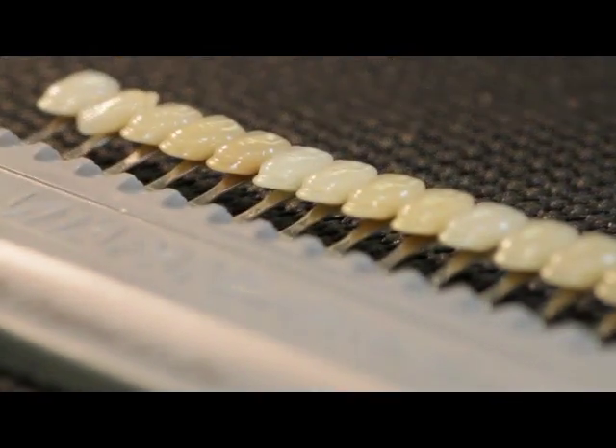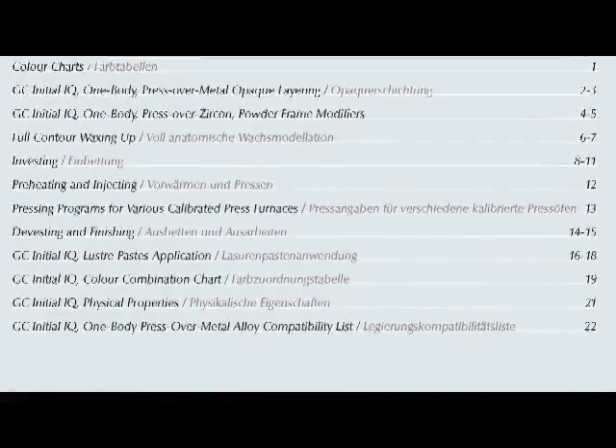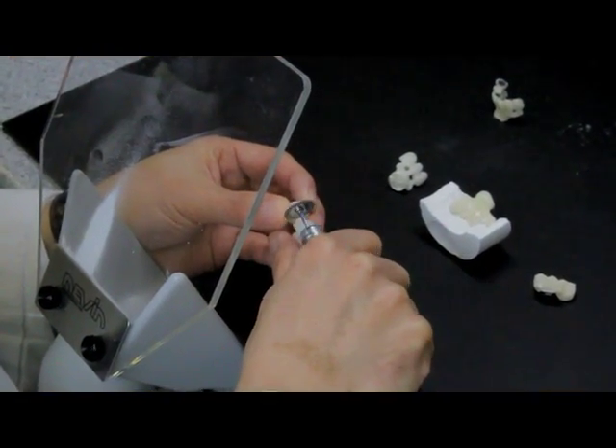To make a perfect Vita shade crown, please follow the basic step-by-step instruction. Before applying the Lustre coating, the ceramic restoration is shaped and contoured using adjusted diamond burrs.